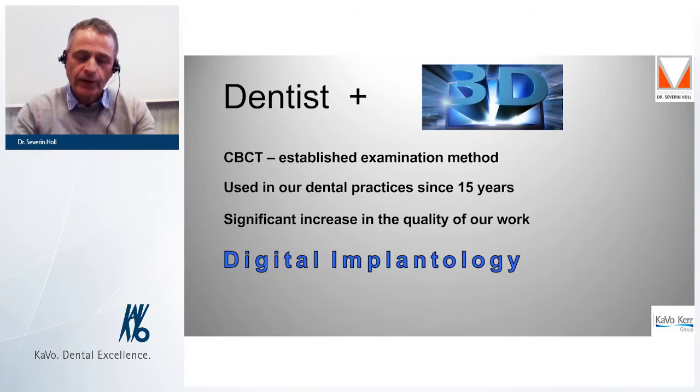What safety do we have today when we use these technologies? We can conclude that the CBCT has become an established examination method in dentistry. We have now been using it in our practices for 15 years, and we can detect a significant increase in the quality of our work. But especially in the field of implantology, with the help of CBCT, new methods of treatment came up.